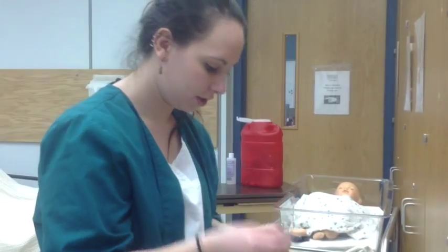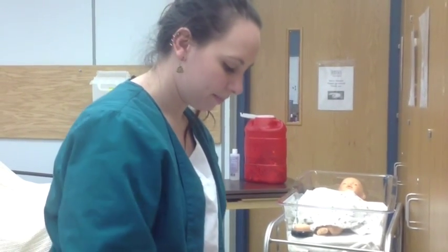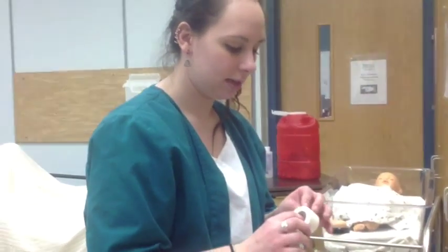So my safety shield's up. I have my medication drawn. I'm going to grab my supplies that I need, which is one alcohol swab, cotton pad to press on after the injection, and tape.